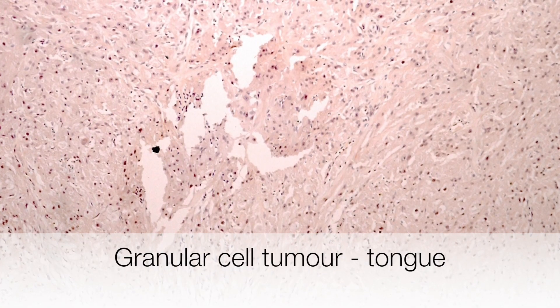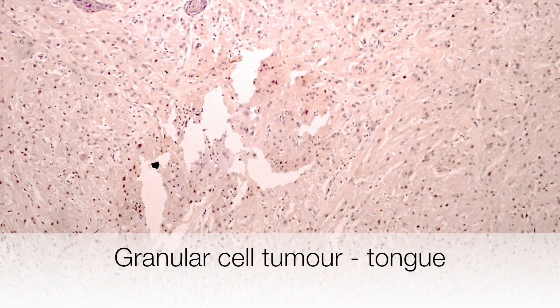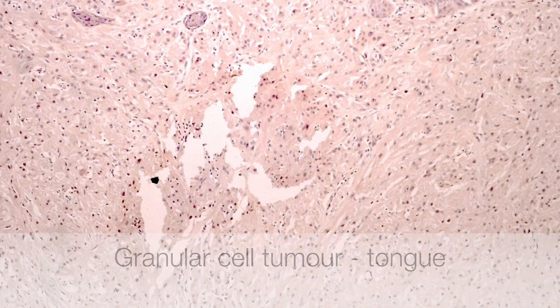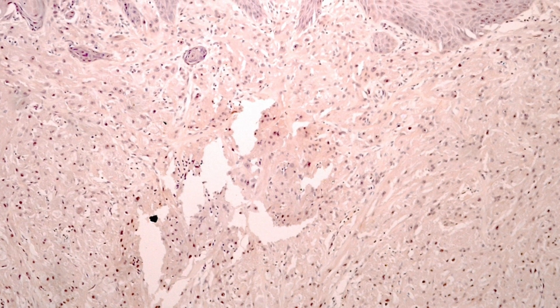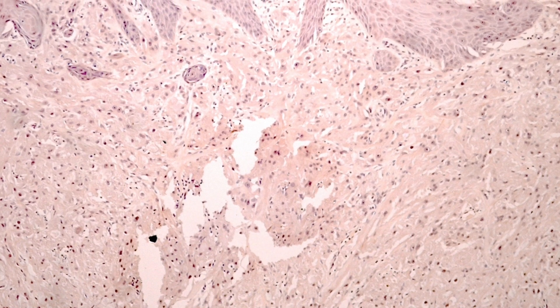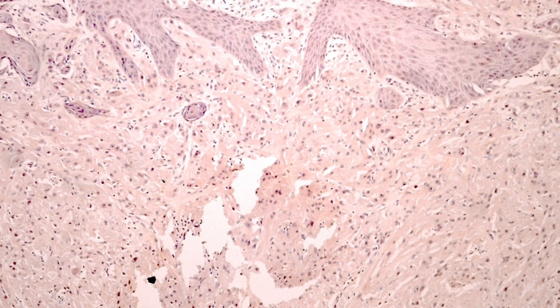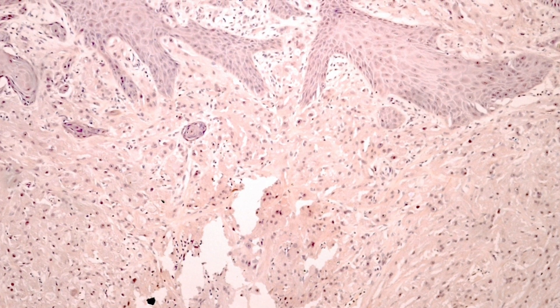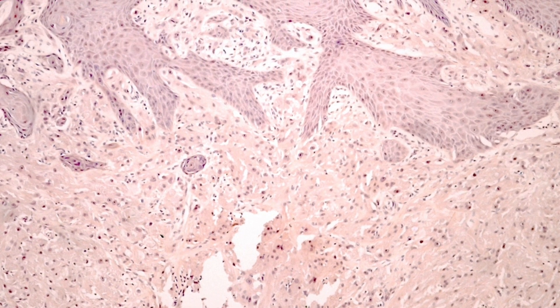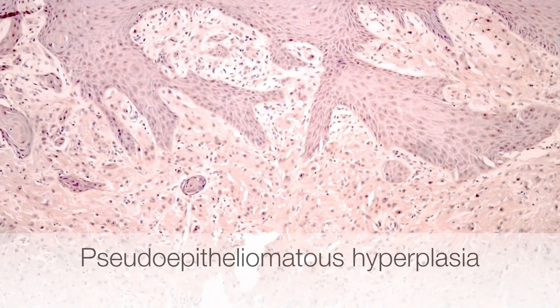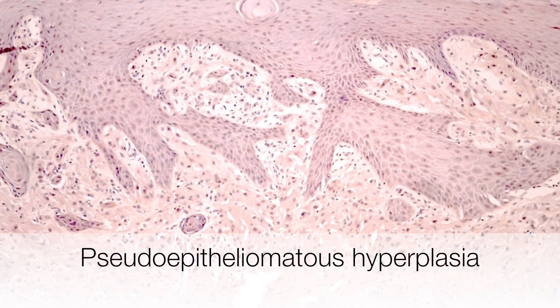Finally, this is a granular cell tumour of the tongue. The granular cell tumour is the pale pink staining area towards the bottom of the picture, and at the top you can see the stratified squamous epithelium. The stratified squamous epithelium has very irregular tongues at the basal aspect that appear to be pushing into the submucosa, which could be easily misinterpreted as infiltrating squamous cell carcinoma. This is a good example of pseudoepitheliomatous hyperplasia in the stratified squamous epithelium overlying a granular cell tumour.